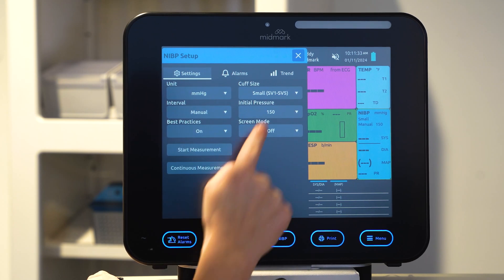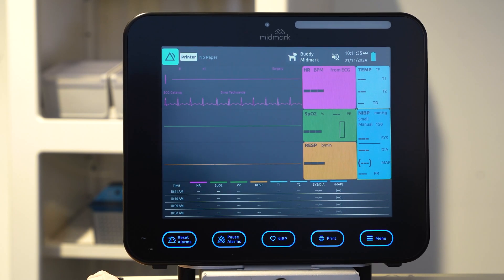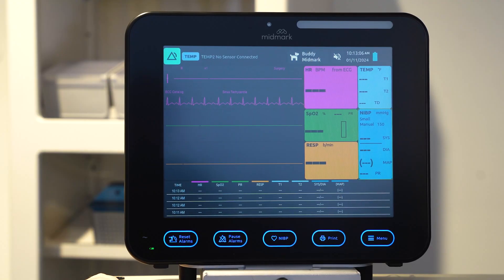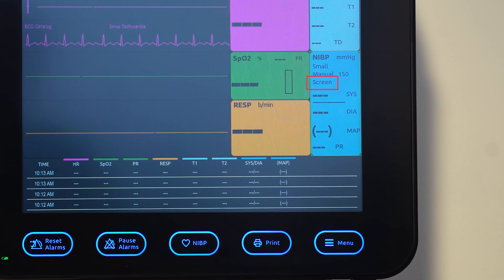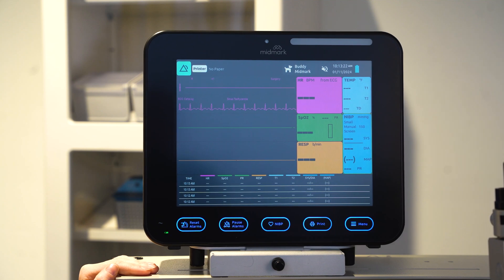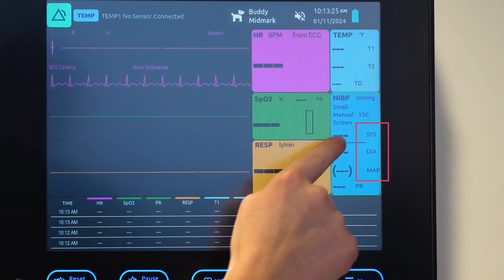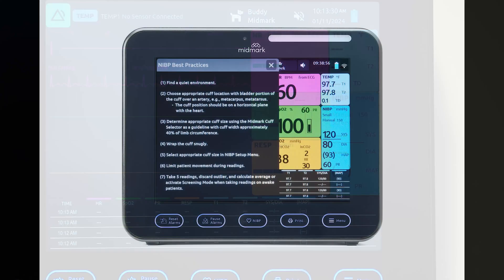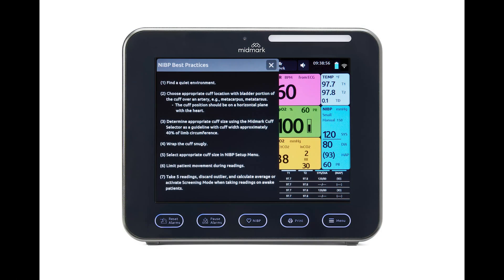To initiate blood pressure measurement, press the NIBP button on the monitor touch screen. To turn on NIBP screening mode, press and hold the screen BP icon. The word screen will appear in the NIBP box to show the screening mode is enabled. Your monitor will automatically take five readings, remove the outlier, and return an average of the systolic, diastolic, and mean arterial pressure. Each time the monitor is restarted, the NIBP best practices reminder will be displayed.